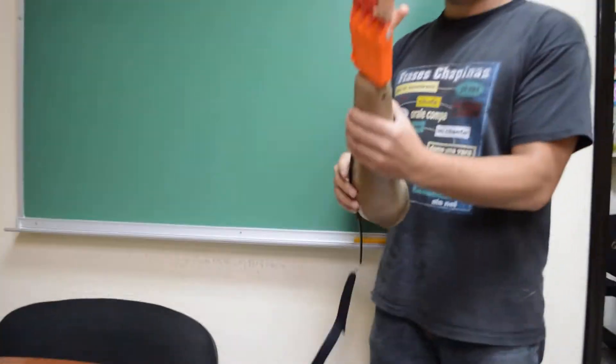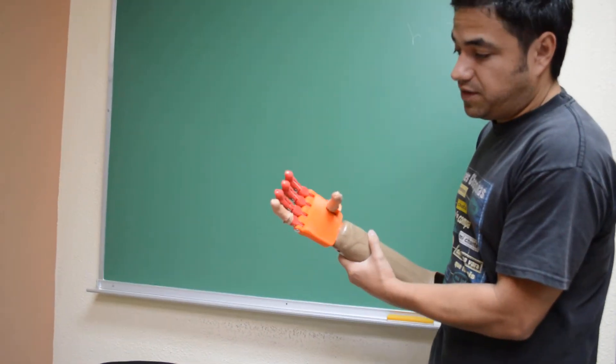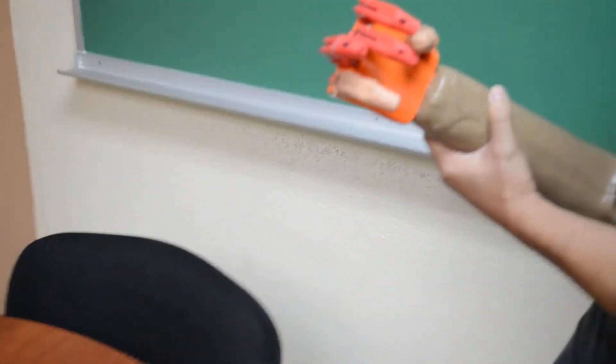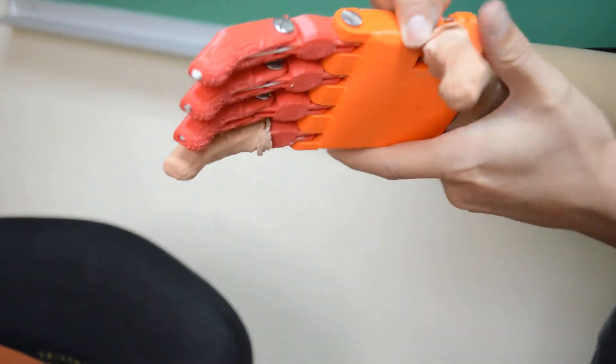So what we did is, here we have this initial position where we can, for example, do tripod grasp. If I want to change it, then I will just push here, rotate the thumb to the desired position, and let go.